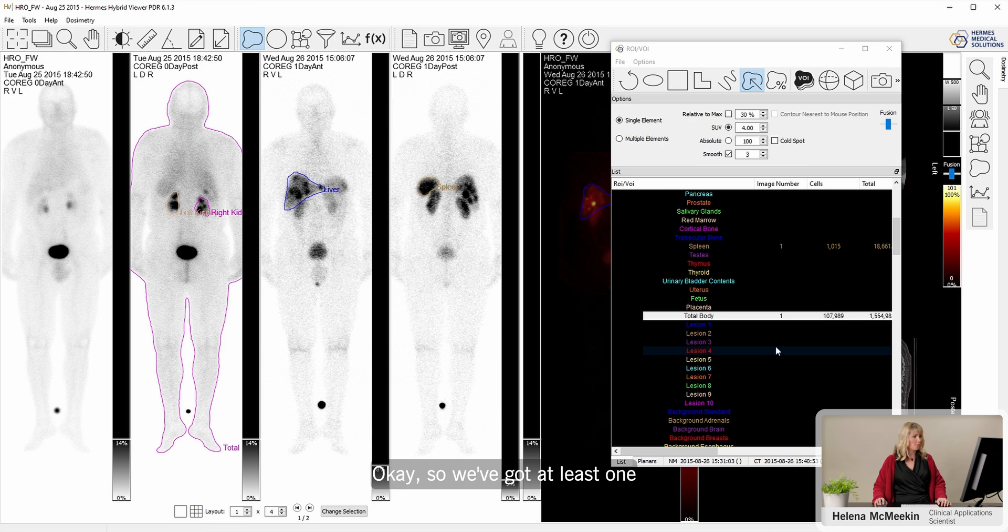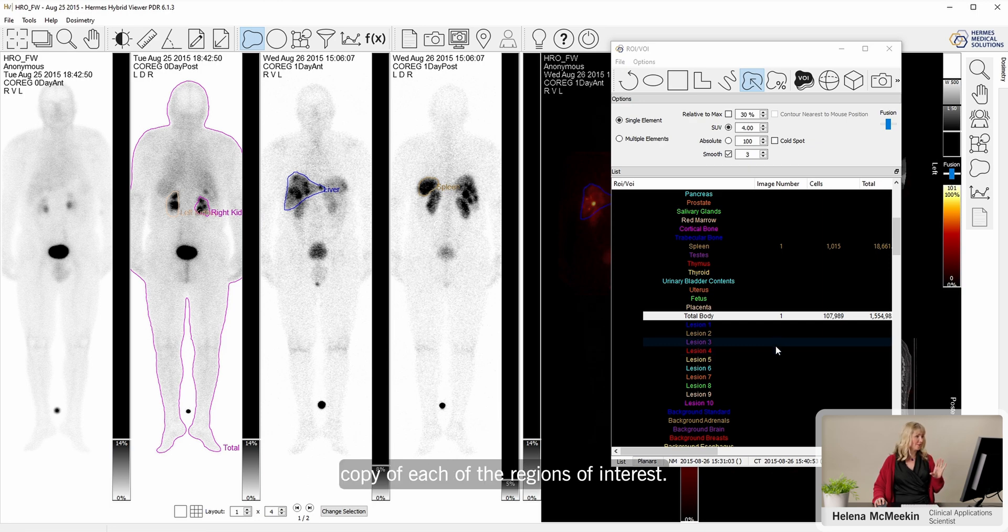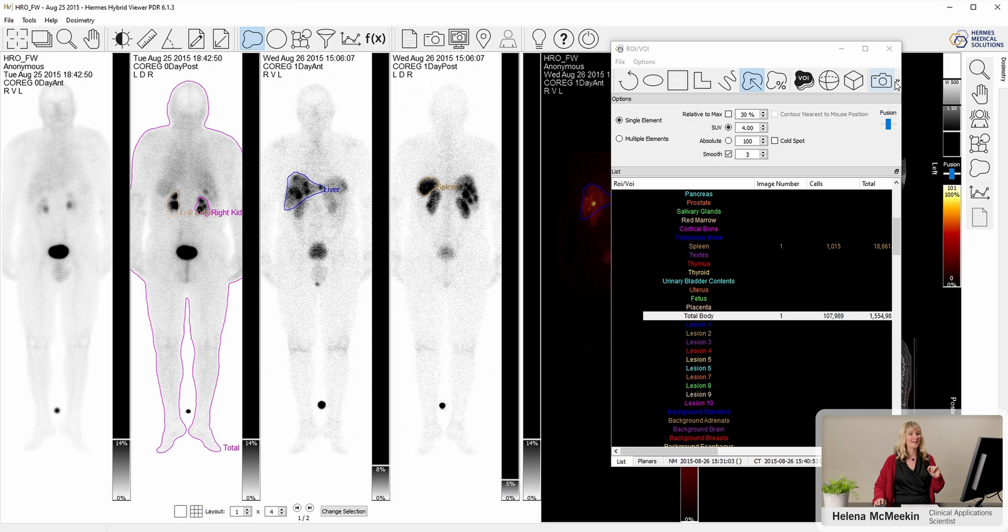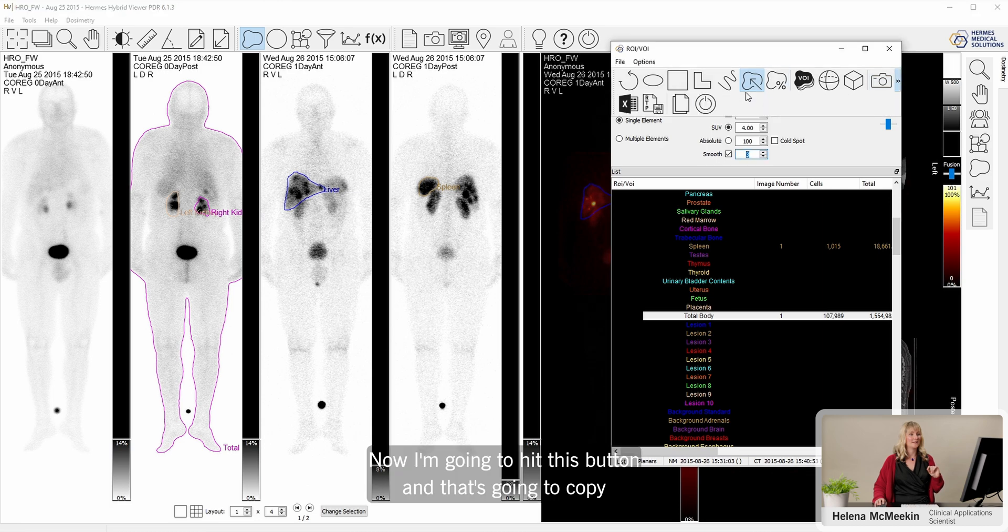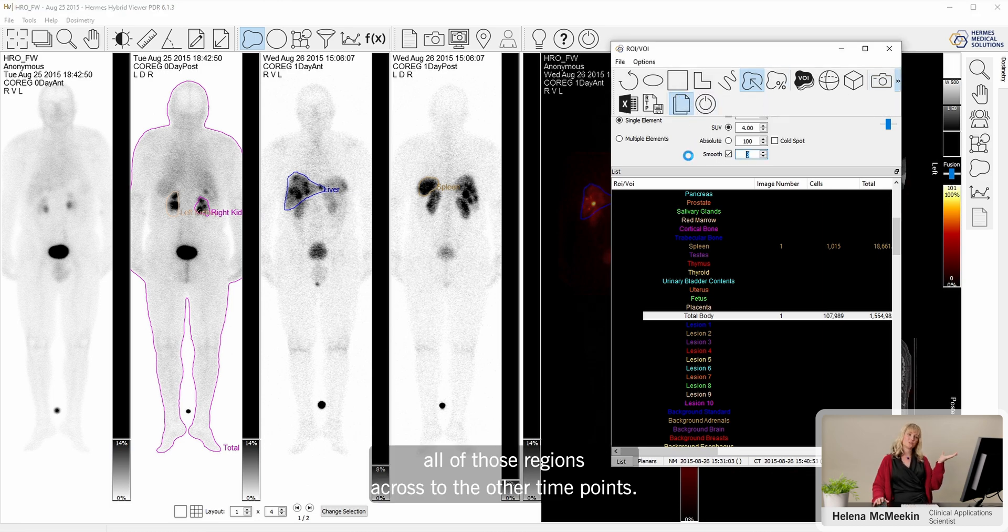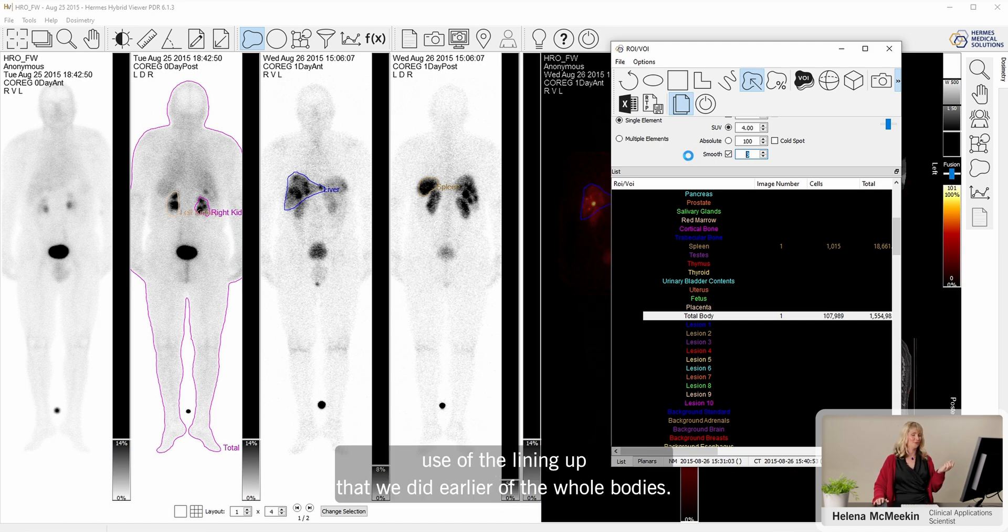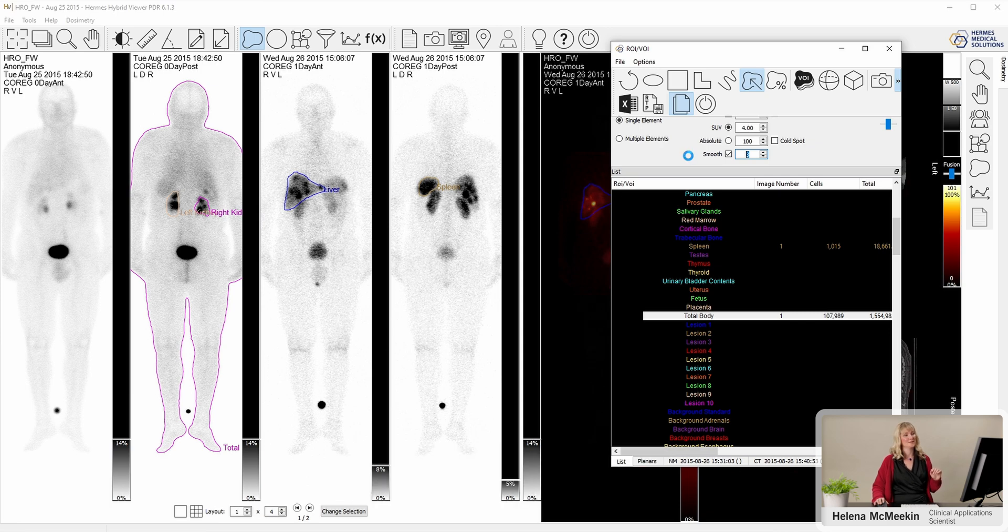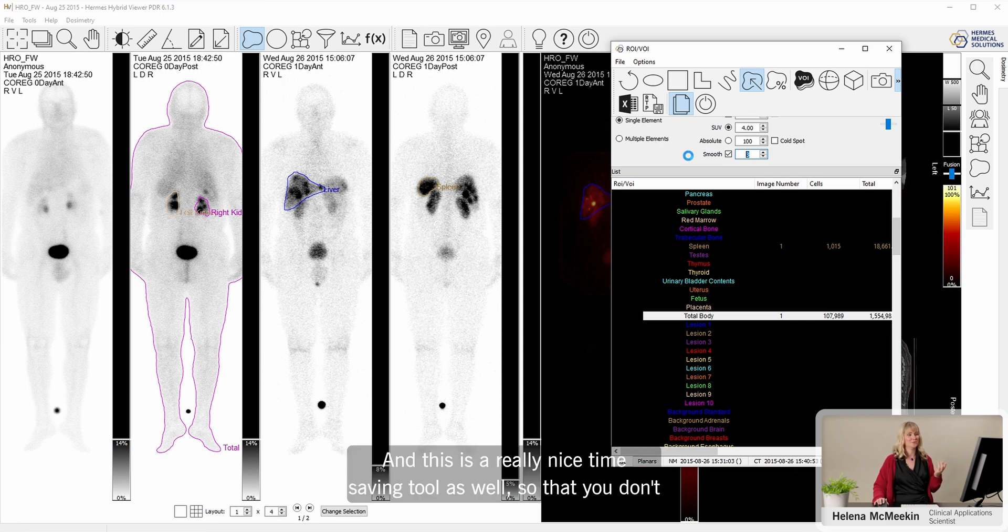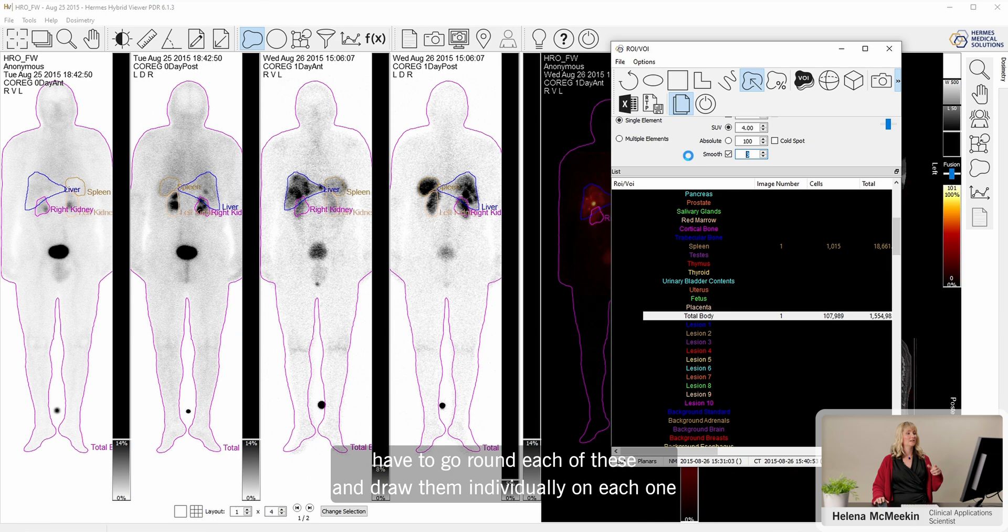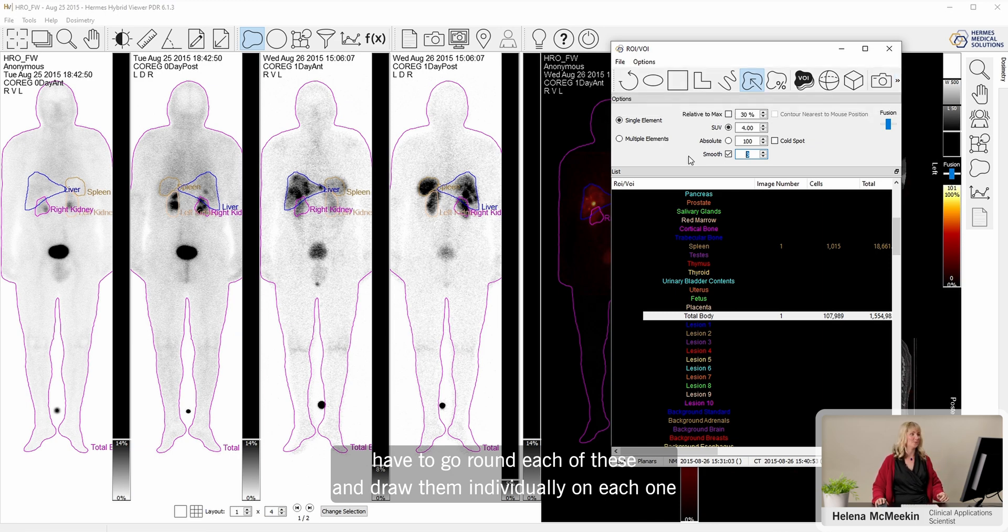So we've got at least one copy of each of the regions of interest. Now I'm going to hit this button, and that's going to copy all of those regions across to the other time points. This is where we make use of the lining up that we did earlier of the whole bodies. This is a really nice time-saving tool so that you don't have to go around each of these and draw them individually on each one.